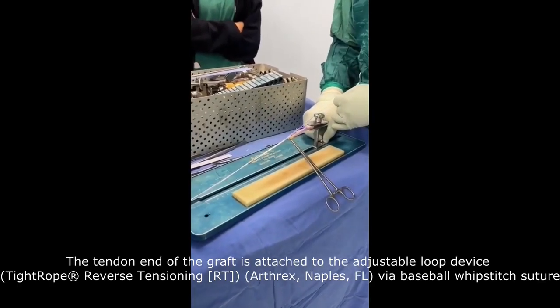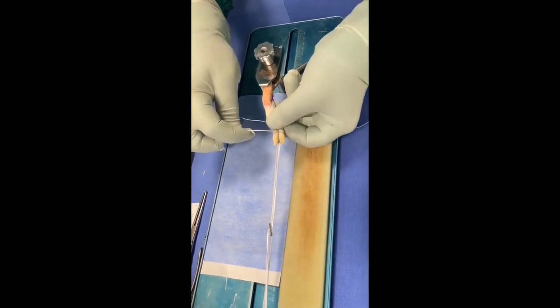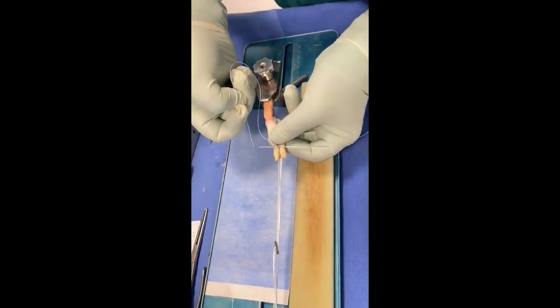The tendon end of the graft is attached to the adjustable loop device via baseball whip-stitch suture and represents the femoral end, while the bone block represents the tibial part.